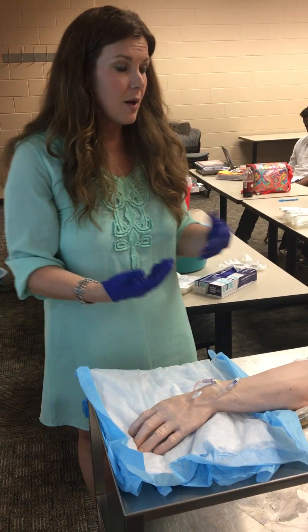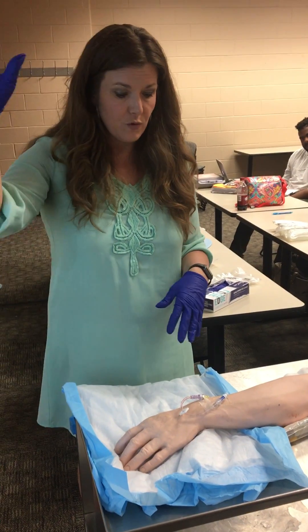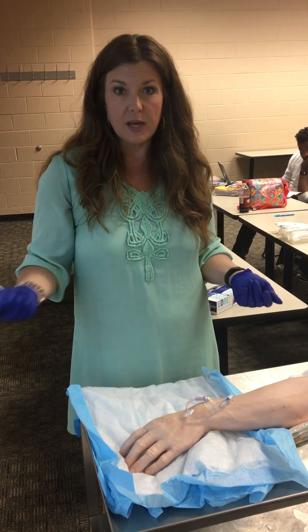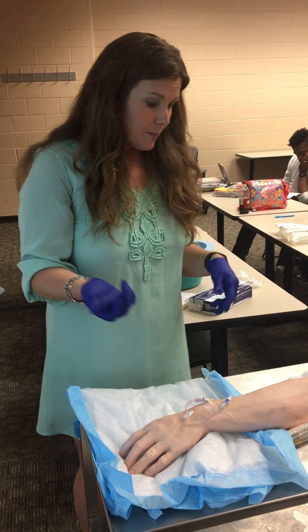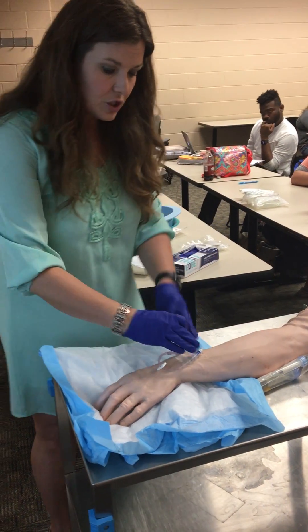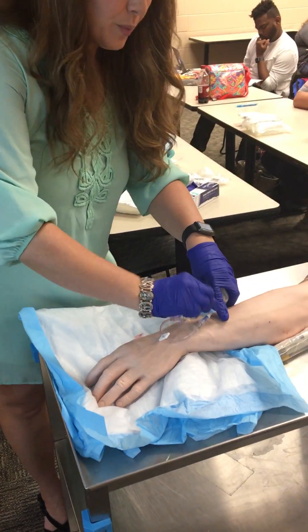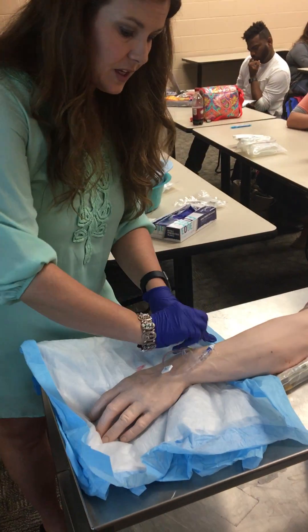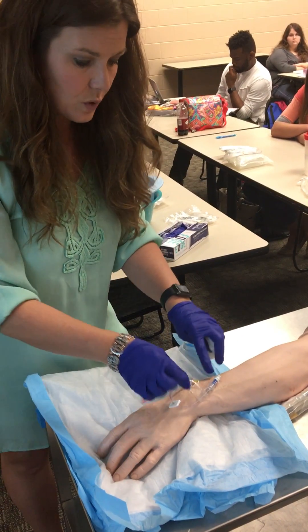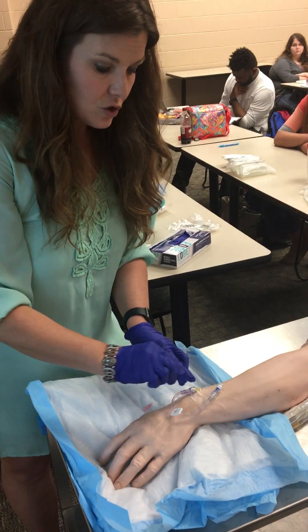The next part is if you were coming in to discontinue an IV. The very first thing you'd want to do is stop your flow — if you had a fluid going, clamp it, turn it off, turn the pump off, so it doesn't drip everywhere when you take it out. Then you'll want some kind of 4x4 or 2x2. You don't actually have to remove the dressing for this check-off, but in real life you would gently pull back the tape, applying traction, lifting up the transparent dressing and pulling it all back away.